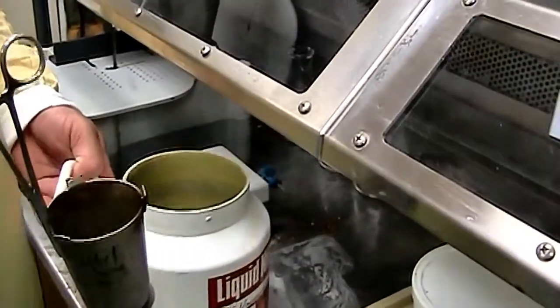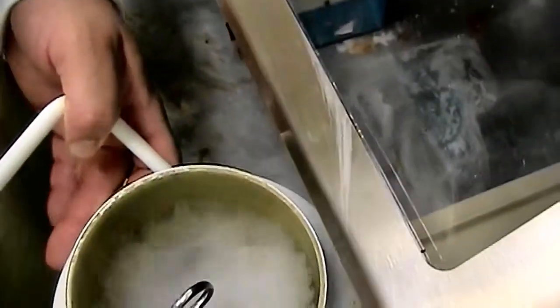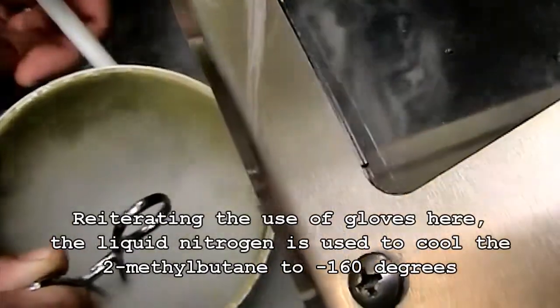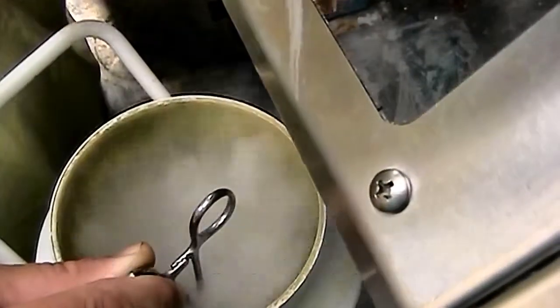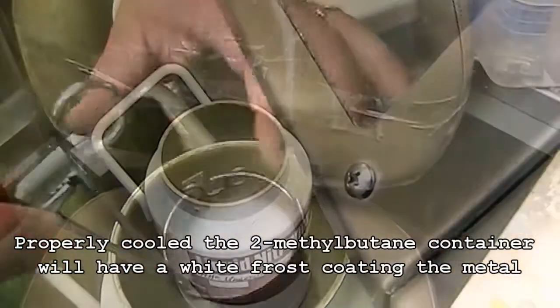Okay. Can't just drop it in there. Because what happens is it starts to boil, and what you're just trying to get the 2-methylbutane to is negative 160 degrees. And when you get there, it will have a white crust surrounding the outside of this.